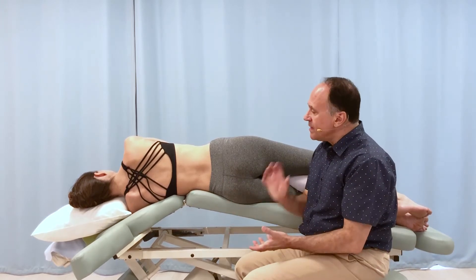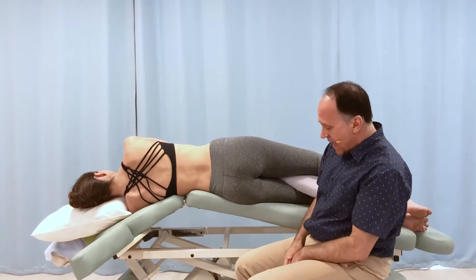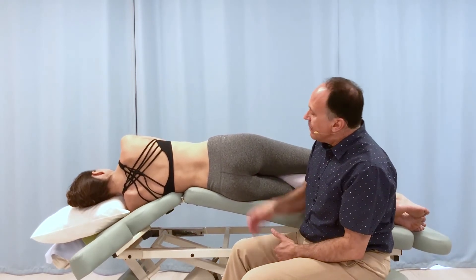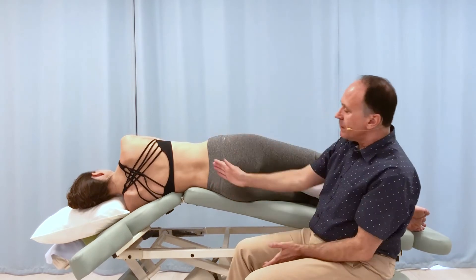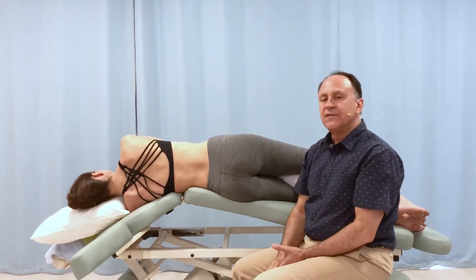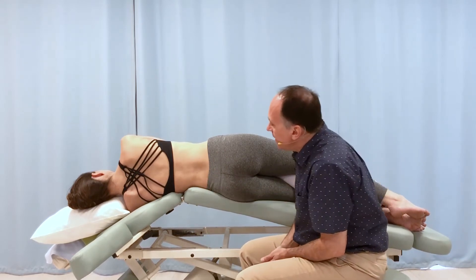The last thing we want is a very quick stretch causing a muscle spindle reflex and the resultant muscle spasm. Catherine is a dancer — she's very flexible — so I can bring her up to the maximum lateral flexion break of the table and she's still perfectly fine.